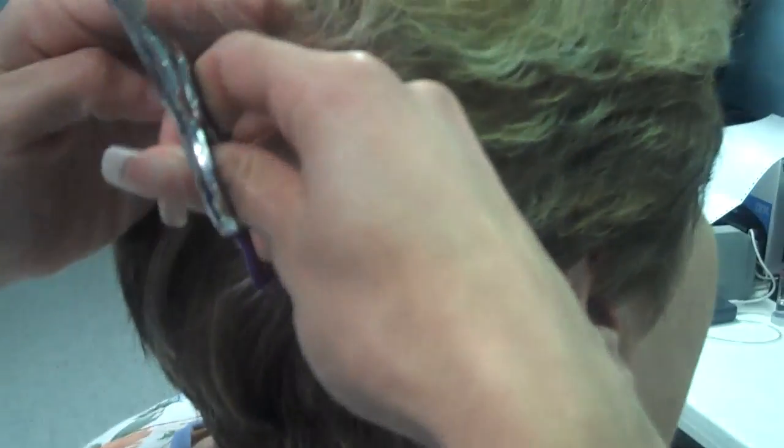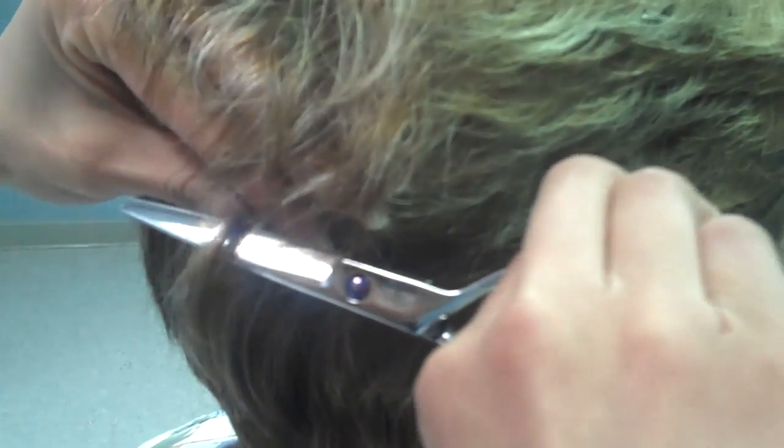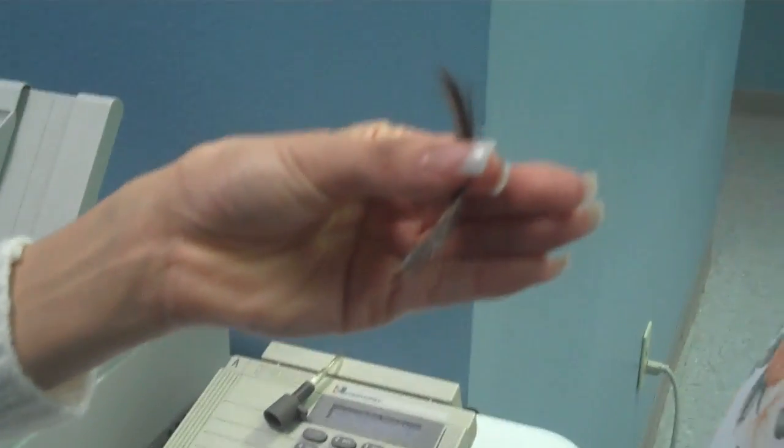We try to skip around to get our three spots. We don't take big plugs out of people's hair because it shows and it looks bad — we want them to look good. So we take it in three different areas, each one the size at the end of a pencil. Make sure the hair you're getting is a segment that's an inch and a half long, the size at the end of a pencil. Lay your blades as close to the scalp as you possibly can prior to cutting, and cut it even with the scalp.